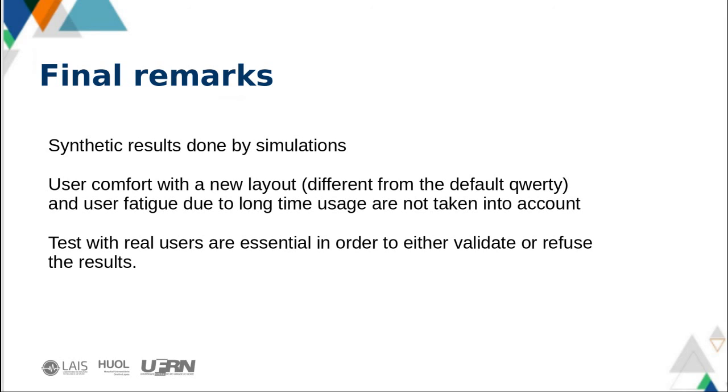Although the keyboard has been developed to be as comfortable to use as possible, some difficulties need to be overcome. The most obvious is the user's initial difficulty in accepting a new keyboard layout, different from the QWERTY. In addition, keyboards using scanning methods should always look for alternatives to reduce the waiting time. The new proposed layout is an example of it. Finally, for a better user experience, the system should be capable of detecting other languages within the text, in both prediction and speech features.